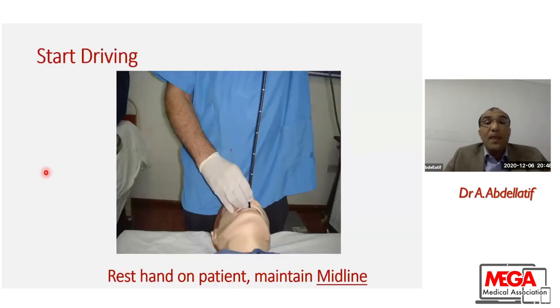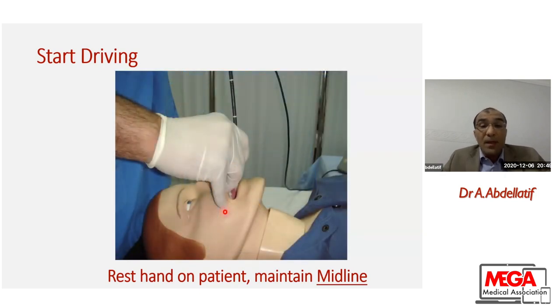Start driving. The most important thing here is I have to rest my right hand on the patient face to give stability to the scope, to maintain the midline. Because if I release my hand and hold it away from the patient face, the scope will go to the left or to the right of the patient mouth. And this will make me lose the midline, which is very important. I have to maintain my midline while driving. So I have to rest the hand on the patient face.